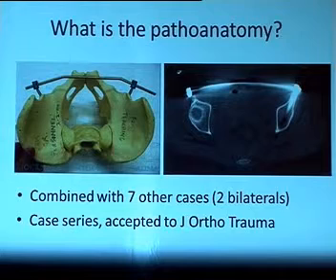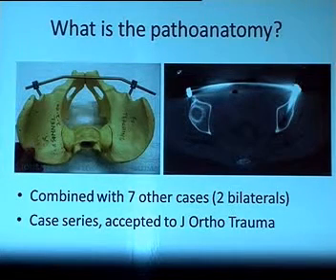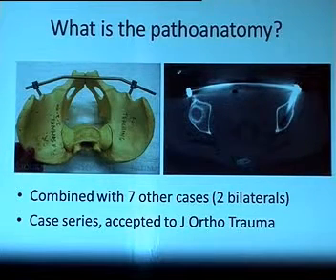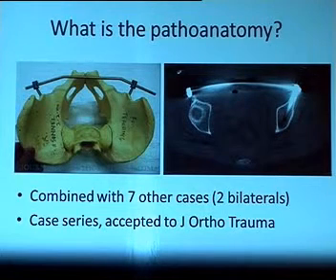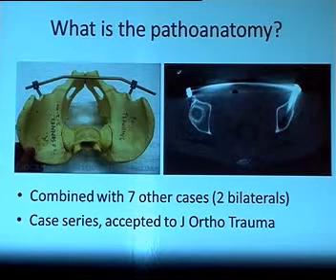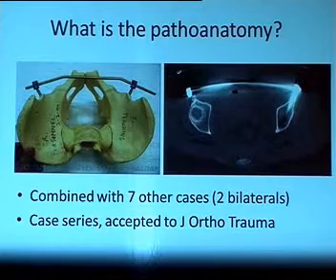In the meantime, I've talked about this case around, and I've had people pull me aside at meetings like this and tell me, oh, hey, I've got one of those too. A couple of friends of mine have bilaterals, including one with arterial embarrassment that had to be rushed back to the OR and have the frame removed. So we now have a small case series, which I think, in popularizing this little problem, have gotten the original authors to reevaluate where the pedicle screws went and how deep that bar must sit. So think about that if you are engaging the infix craze.